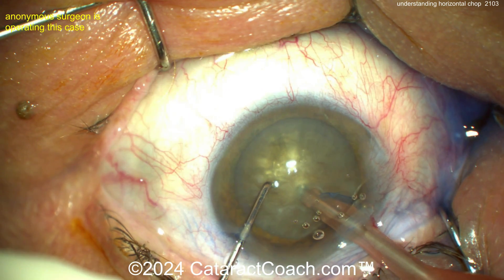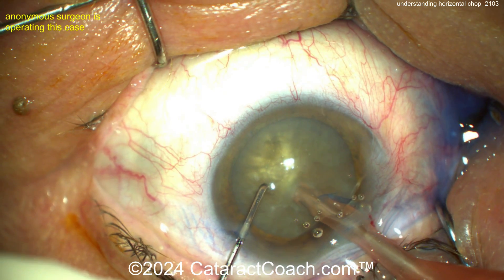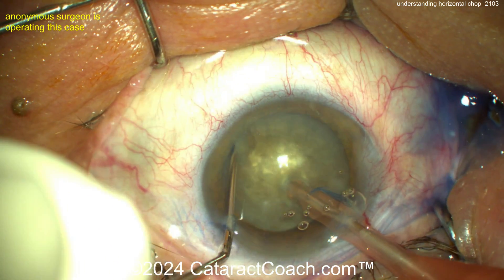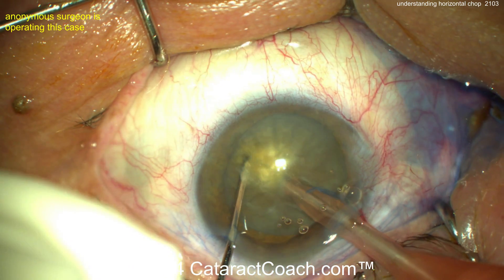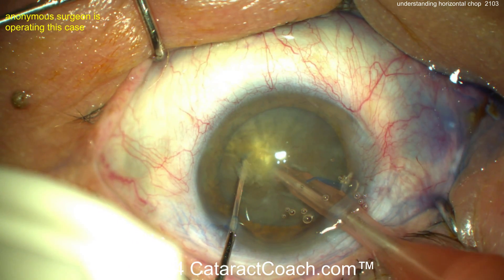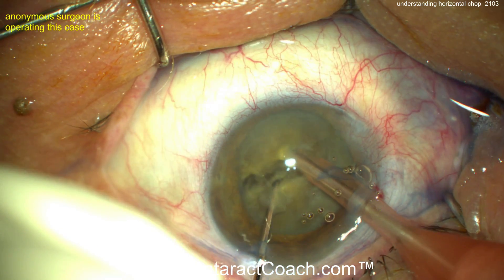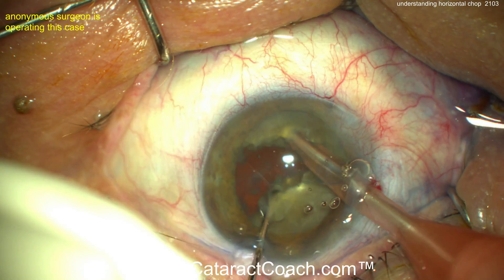Occlude the tip, then buzz into the nucleus. Now retract your foot to position two so you have high vacuum. The chopper goes around the lens equator, under the rhexis. Bring the two instruments together, then switch 90 degrees and pull apart — that propagates the chop all the way through.